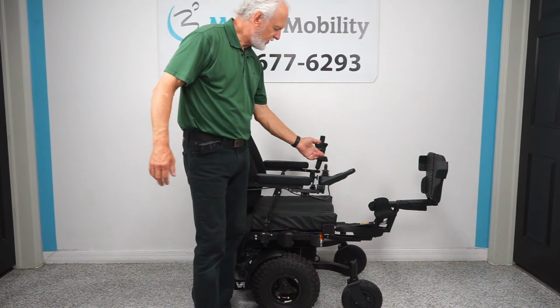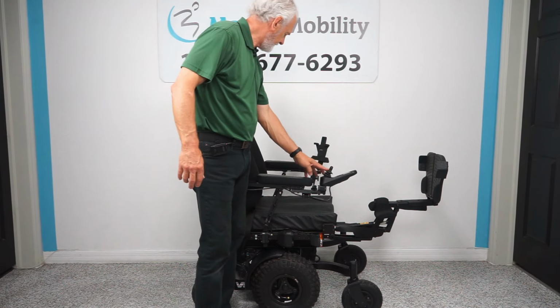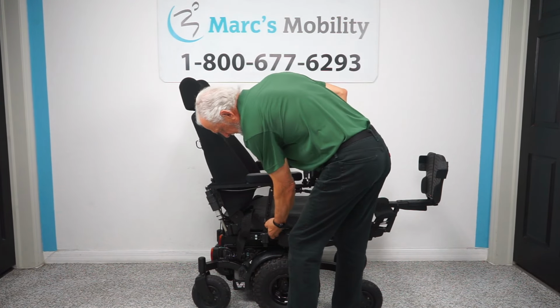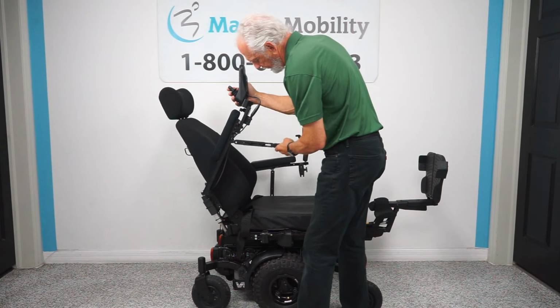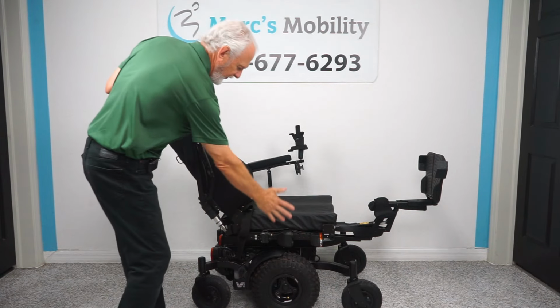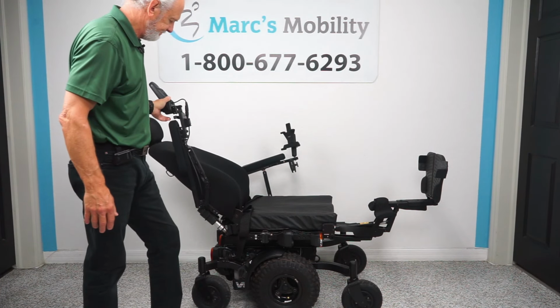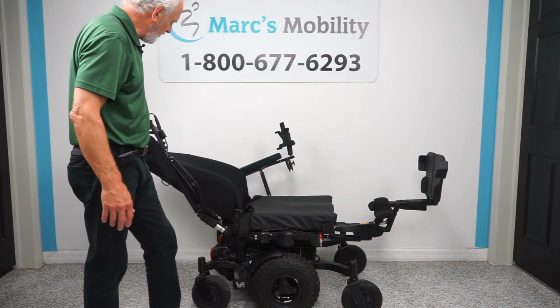Next, I'm going to move the joystick sideways until I see the back is black. There we go. And now I'm going to move this way. So this one here, you see the back is reclining. And you see these arms have arm support also, which I'll cover in a minute. And you can raise the arm up. So if you transfer from the side, from one chair to another, you jump into your chair instead of going from the front, there's nothing stopping you here. And this is your back reclining. And this is as far as it'll go, right there.